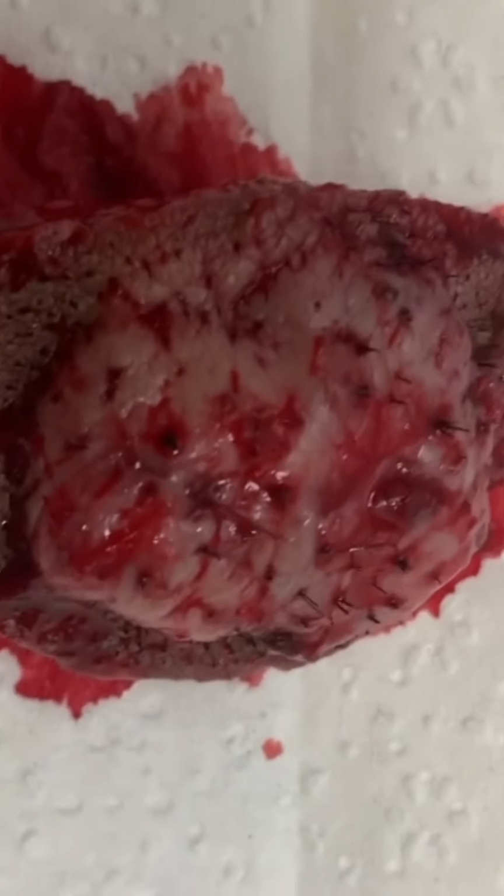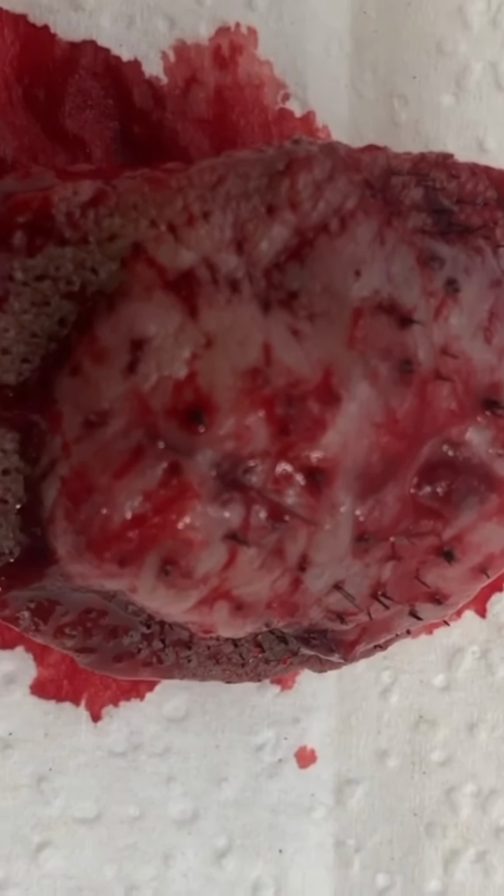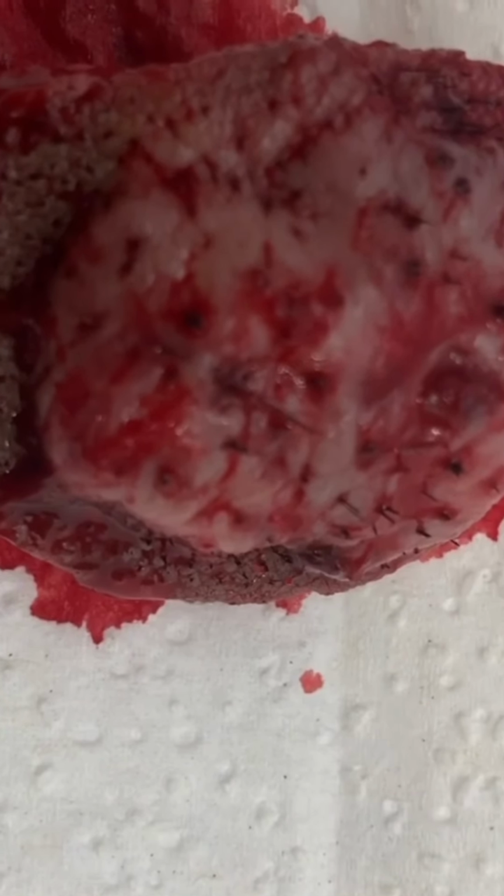And so we'll send this to pathology. You can see that it was a nice excision with a fairly clear margin, but I don't think it's going to be a tumor per se, but rather a keloidal reaction with scar. But we'll see, make sure it's not a tumor of any kind.